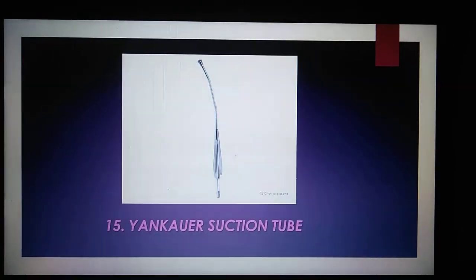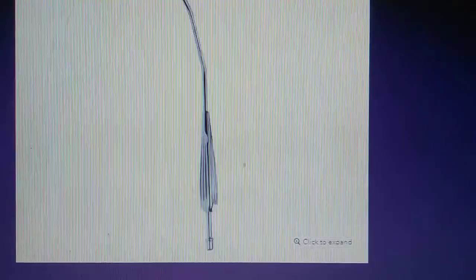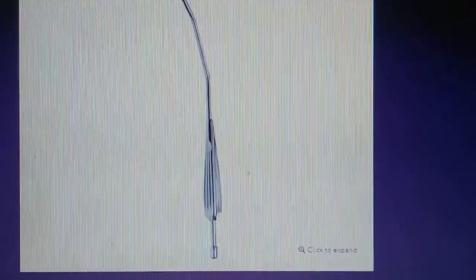The Yankauer suction tube is used to remove fluid or debris away from the surgical site, with a tip that can be removed to allow access to tighter spaces.